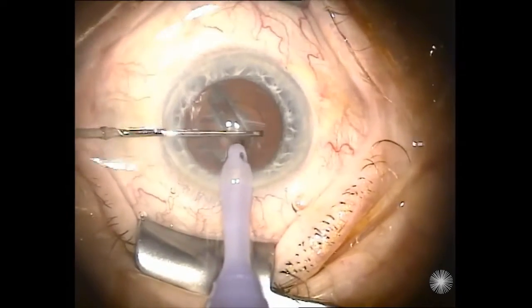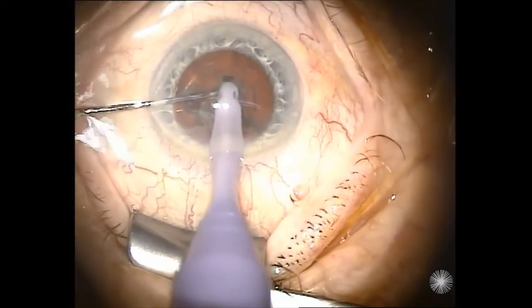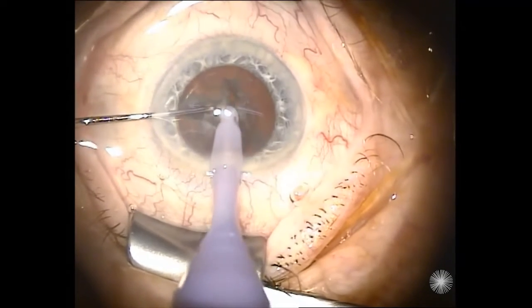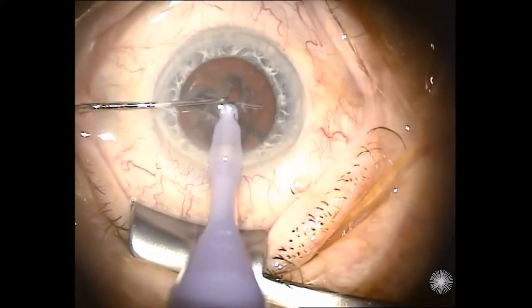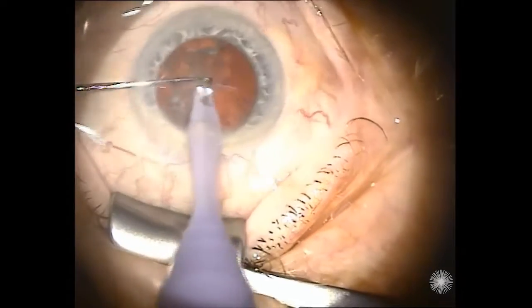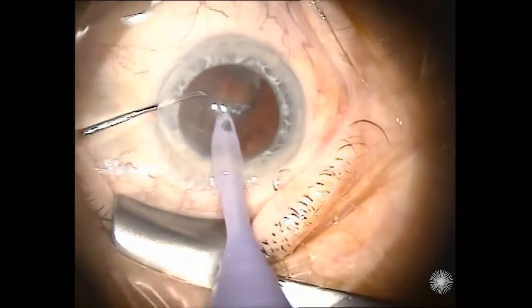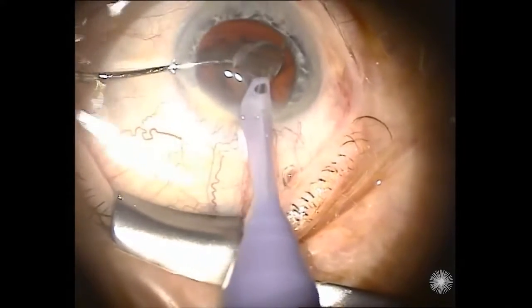To do phacoemulsification, we use a stop and chop technique in this surgery. So we divide the nucleus into 2 halves, then we take each half alone. We finish the first half of the nucleus, so we will crack the second one here. We're using a chopping technique.